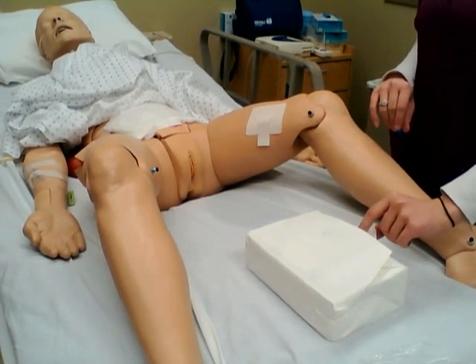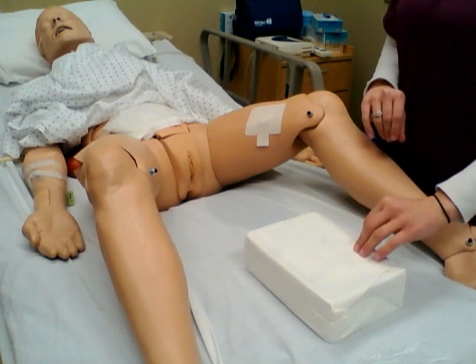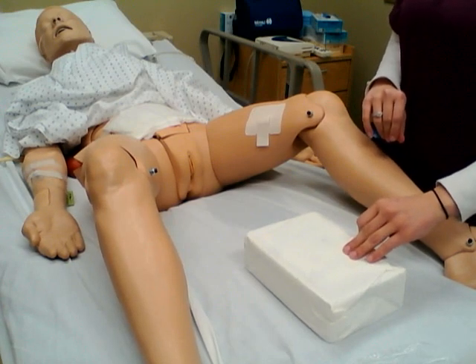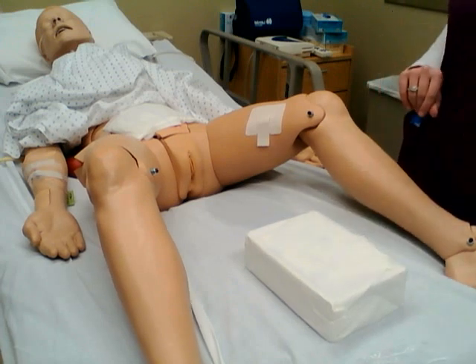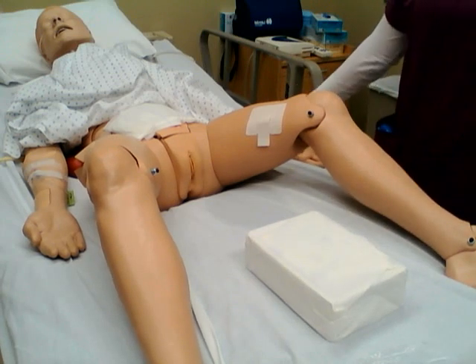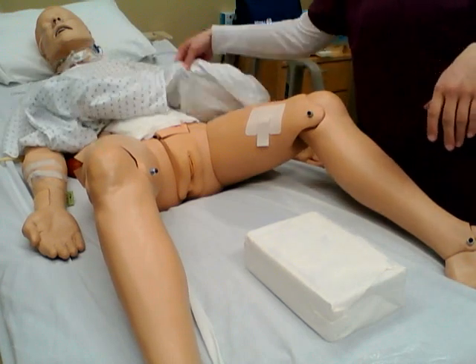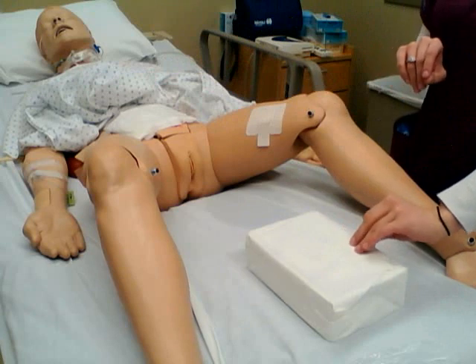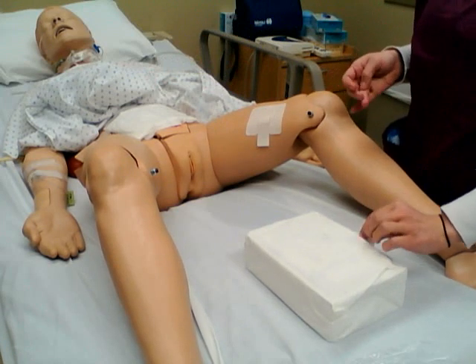Ashley. I am just going to do my video validation for removal and insertion of Foley Cath and also the specimen. For my catheter, I already checked my patient and performed hand hygiene. I also have exposed the patient. Normally you would want to keep him covered, or her covered in this case, for as long as possible.